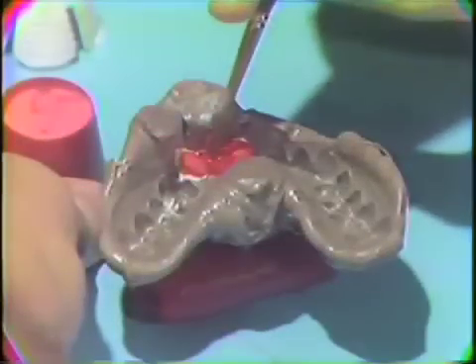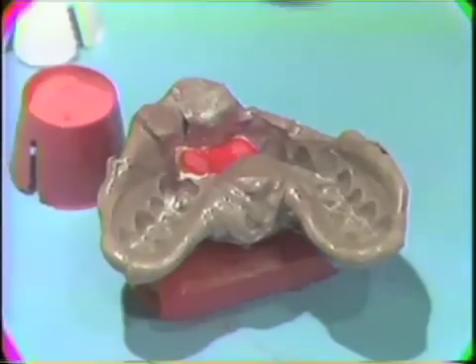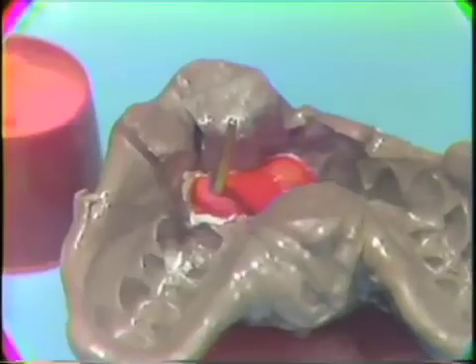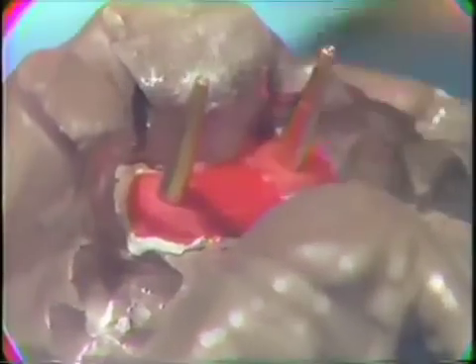When the Duralay reaches the proper consistency, the dowel pins will be added to the shell. Additional Duralay is placed over the ridge area, and when the Duralay has reached the proper consistency, the dowel pins will be placed in their proper position. You will note that when the Duralay has its proper consistency, the dowel pins will not tip — they will be retained in their proper position.